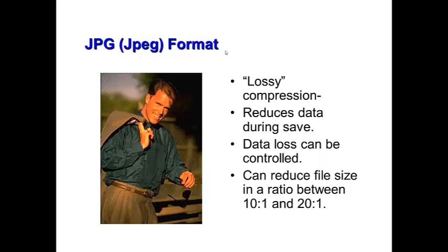We talked about TIF. It uses lossless compression technology inside. But JPEG uses a lossy compression scheme inside. Lossy means some data information will be lost. For an image, that means some details will be lost. Generally, the compression ratio for JPEG is 10 to 1 or 20 to 1. If it's higher, the image will become very blurred.